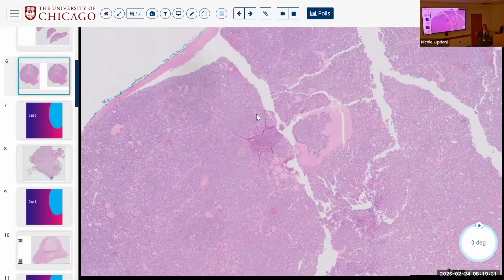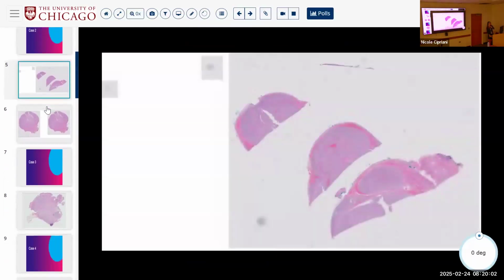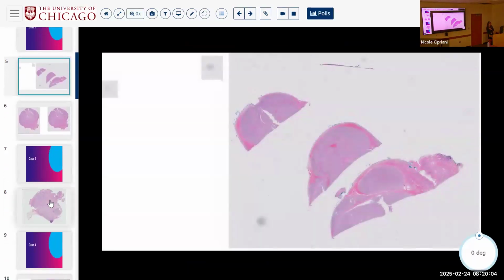Solid areas and mitoses, and what goes with mitosis? Necrosis, right? So you always then have to ask yourself, could it be worse? Is there angioinvasion? In this case, there wasn't. Is there mitoses, necrosis with solid growth? No. So we're not pushing it up into the high-grade cancer. It's just going to remain at a capsular invasion. So this would be minimally invasive follicular thyroid carcinoma, minimally invasive being capsular invasion only, not angioinvasion.